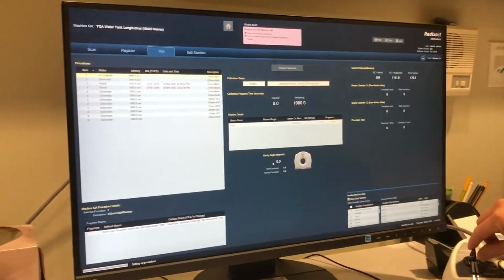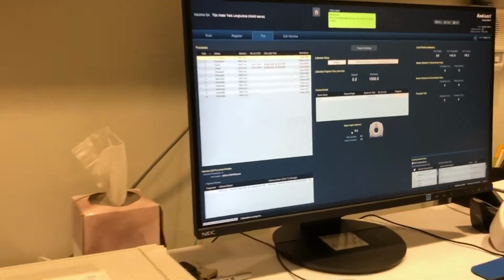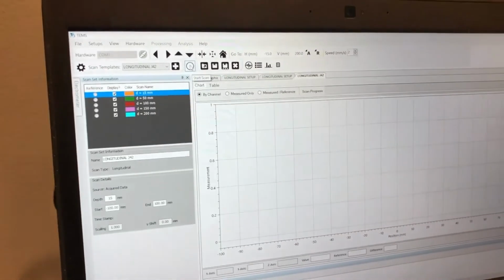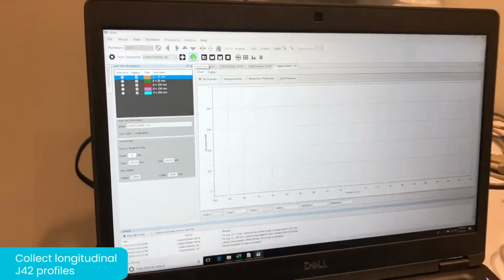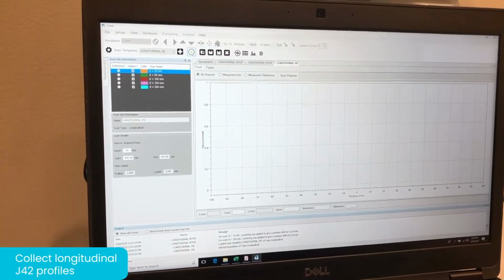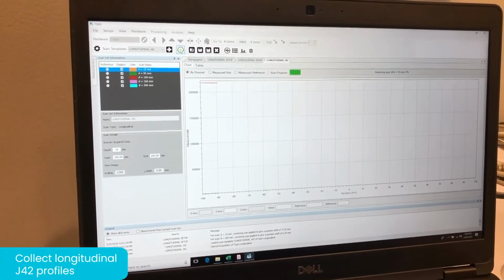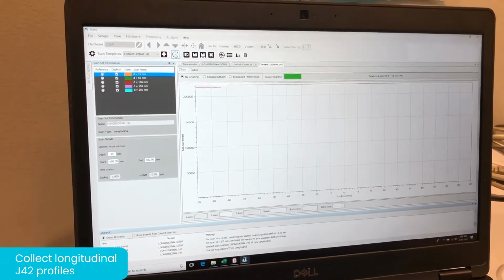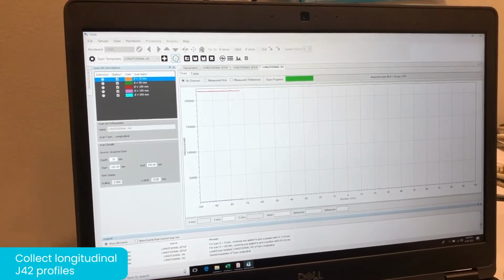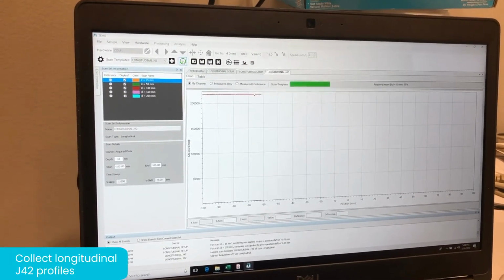I'm going to turn our key to treat, start the beam, and after approximately 10 seconds or so, we will start collecting profiles in TEMS. To start the profile, we'll hit start scan. All of these water tank procedures are created as 1,000-second procedures, so a lot of times you can collect the longitudinal and the PDD profiles for that field width during the same procedure. If you collect your profiles before the procedure or the beam completes, you can just turn the key or hit the yellow stop button on the status console.